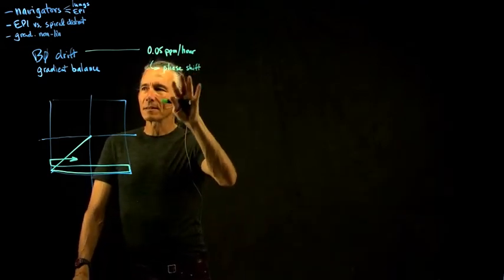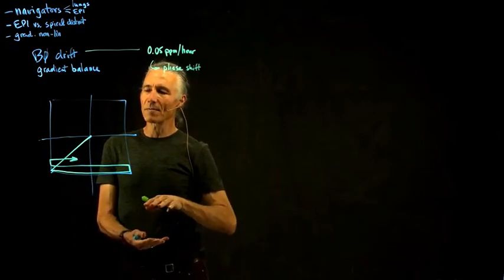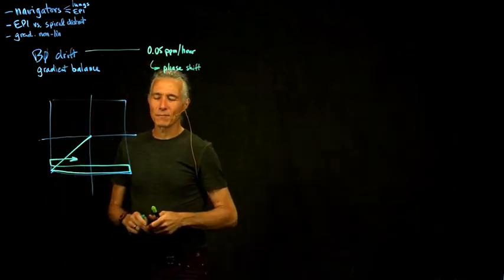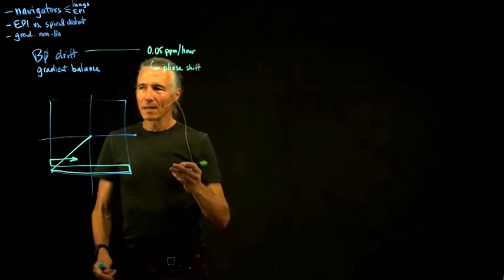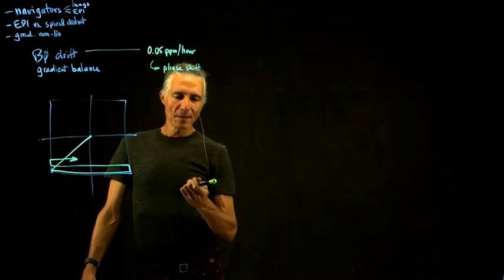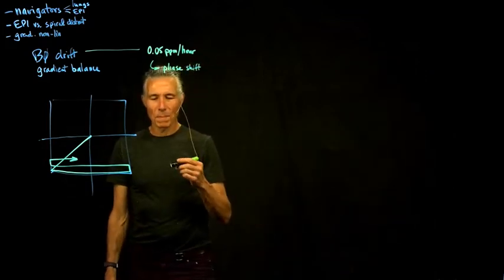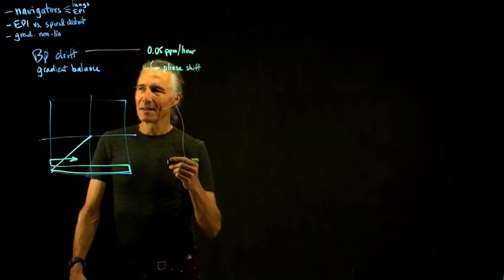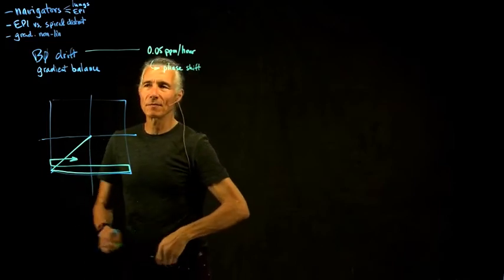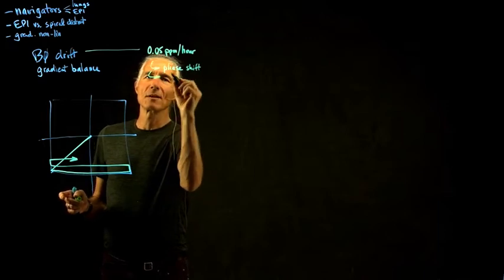You could think of it as, like I said last time, a phase pedestal. So it applies to all of k-space. Basically it slightly disturbs the phase of the signal. You're expecting the precession to start at 0 degrees and go around, but instead it's starting at 10 degrees. That little difference in what you consider to be the phase will cause an image shift. This phase shift is the Fourier shift theorem, so it causes an image shift.